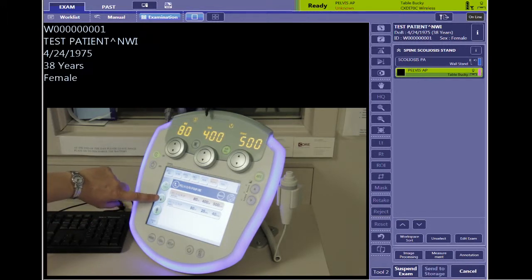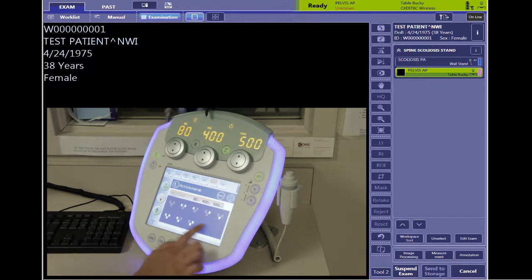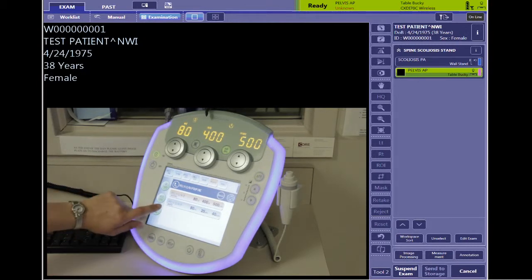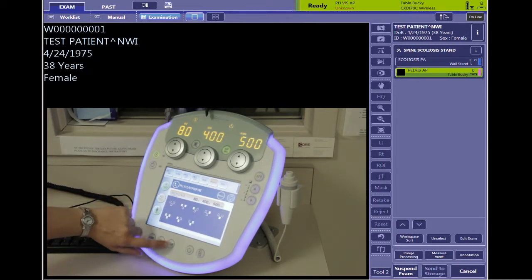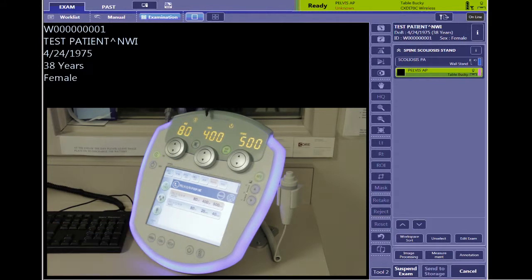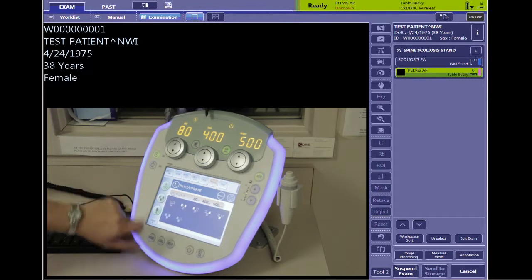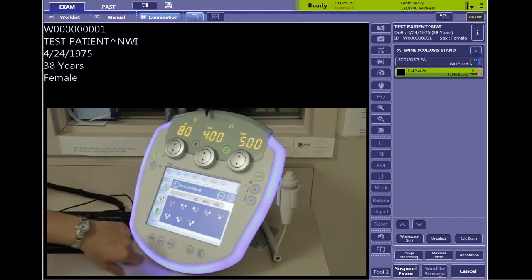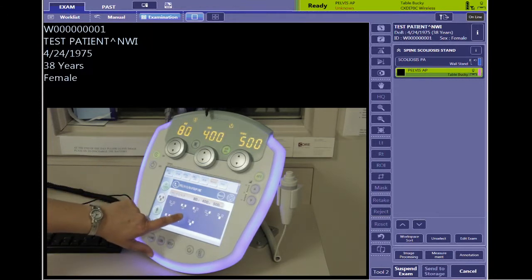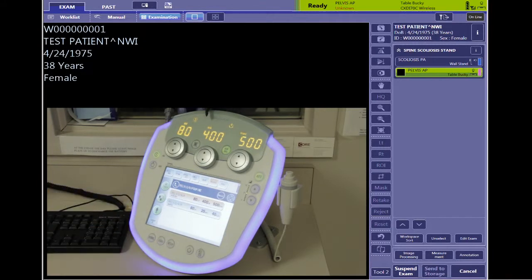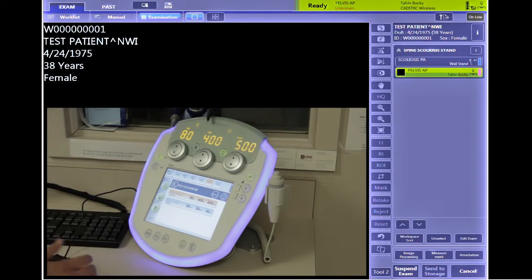The next button down is your photo timer selection. You can select any combination of the three photo timers, or you may turn them all off using this selection. For a pelvis you can choose all three. If you have a patient with a prosthesis — say the prosthesis is on the patient's left — you may want to choose a combination that does not include the photo timer that's underneath the prosthesis.